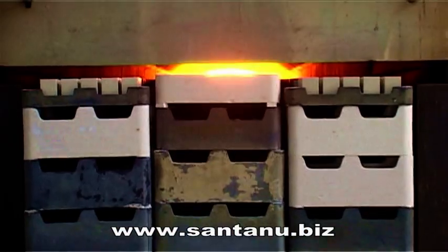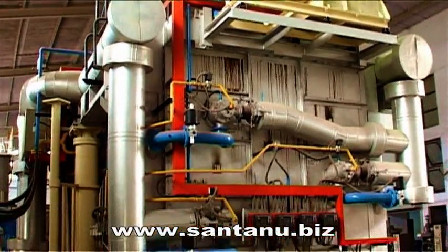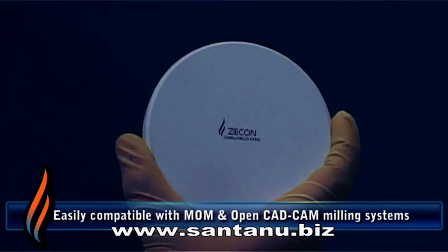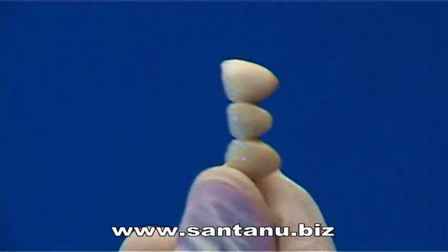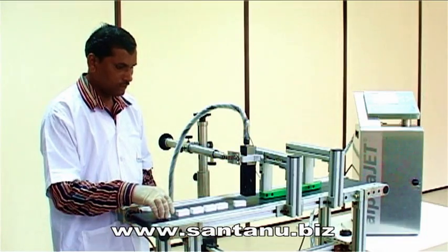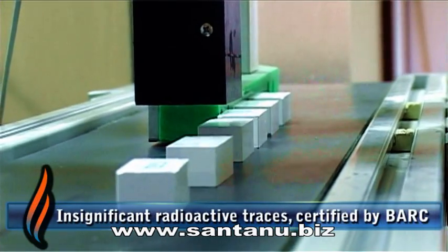Ziecon ceramic blanks are bisque-fired to chalk hardness in the most advanced temperature-sensitive kilns, ensuring uniform hardness, chipping-free smooth machinability and uniform shrinkage for final ceramic dental restoratives. Superior grade Y-TZP powder ensures insignificant radioactive traces in Ziecon blanks.